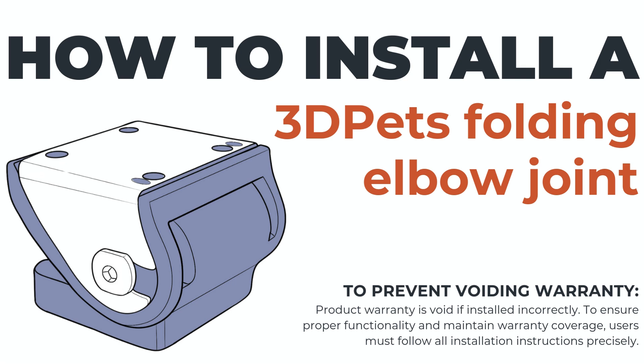This video is going to go over how to install your new 3D Pets folding elbow joint. We will go through the process step by step alongside the instruction manual that comes with your elbow. Please feel free to pause and rewind at any point, and if you have any questions, please reach out to our office at info@3dpetsprosthetics.com with any relevant photos or videos.